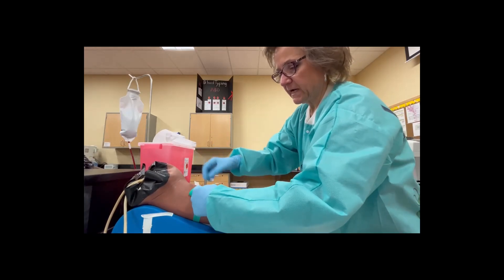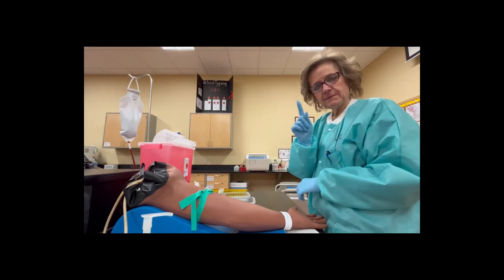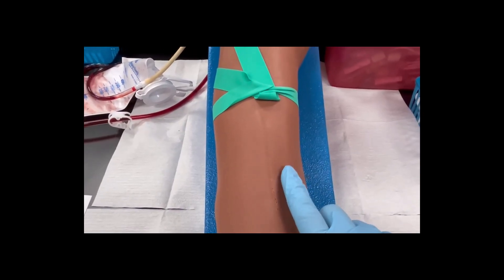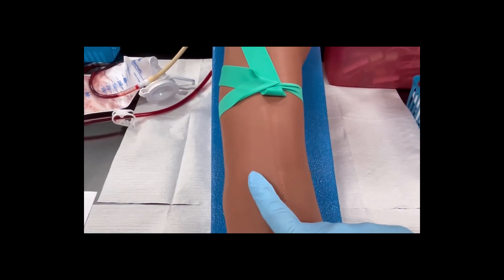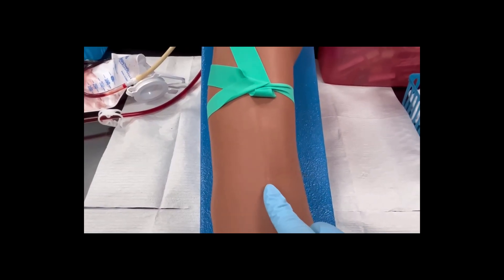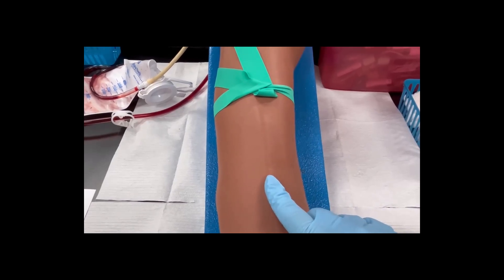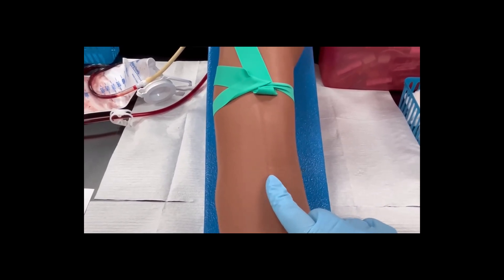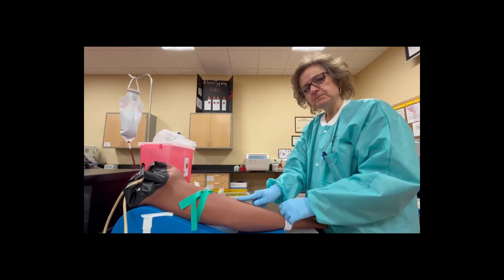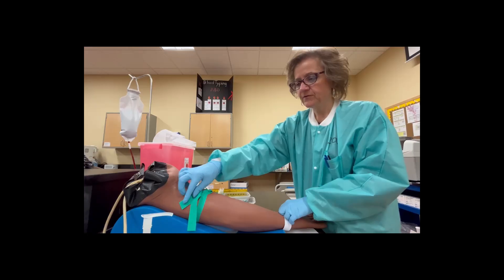Snug but not super tight — if they have a shirt on, feel free to put it over the shirt. With my gloves on, I'm going to take my pointer finger and roll it along the antecubital area back and forth. This patient only has one vein right up the middle, nice and juicy. I'm going to pick where I want to go into that vein, figure out where the juiciest part is, and I want my needle to go just below that juicy part. The vein you see might not always be the best vein.